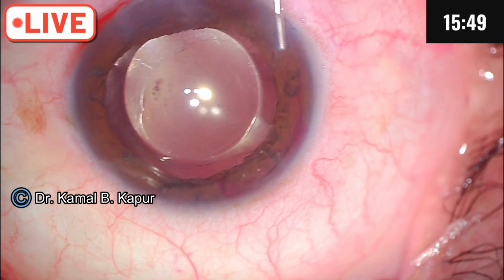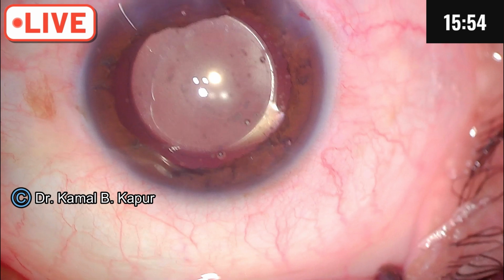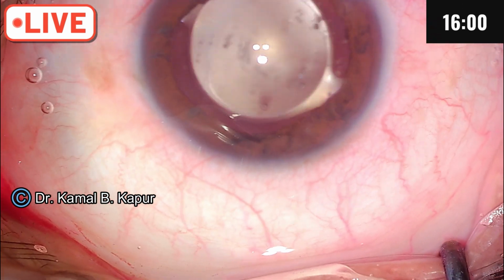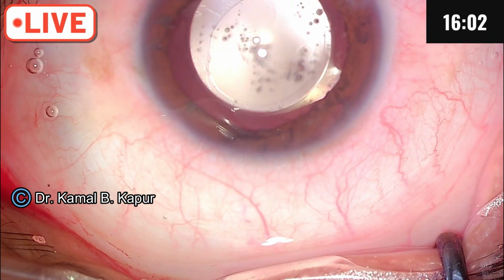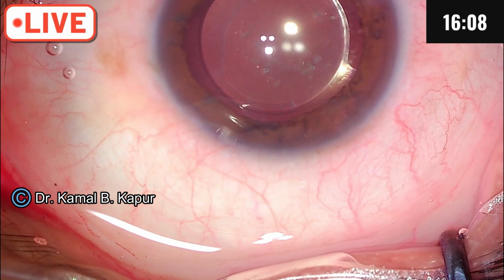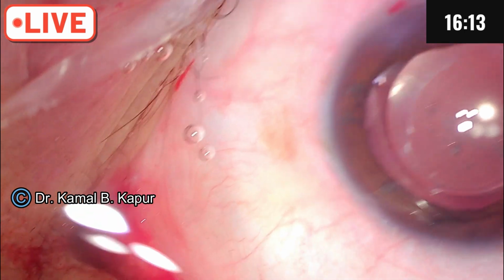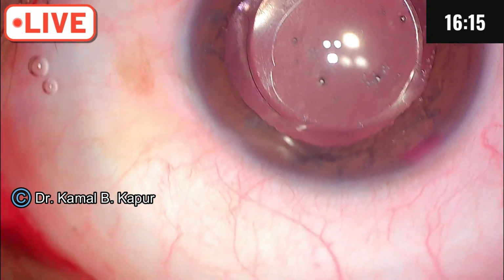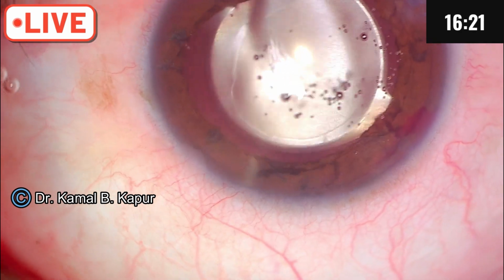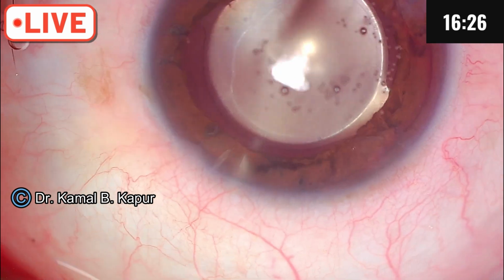So there we are, the case has gone off perfect. We hydrate the wound, never over pressurize such wounds. Sometimes you may be tempted to put in some air bubble. I usually avoid air bubbles in such cases, because sometimes they can actually break the zonule and go behind and then cause a complete loss.